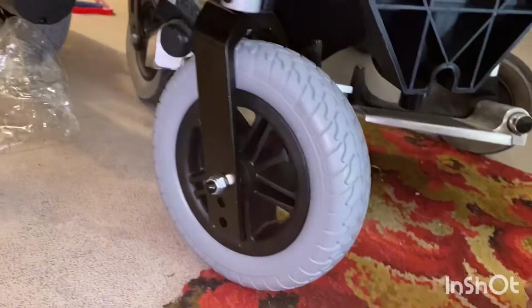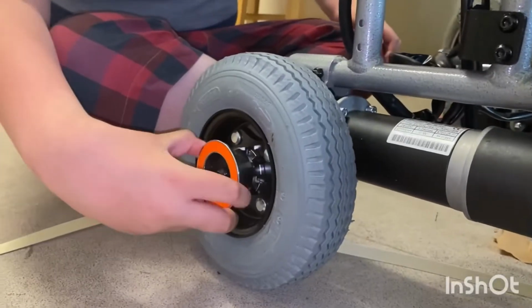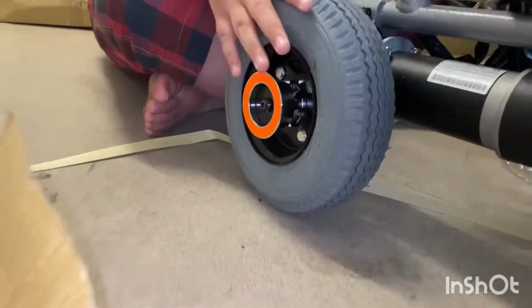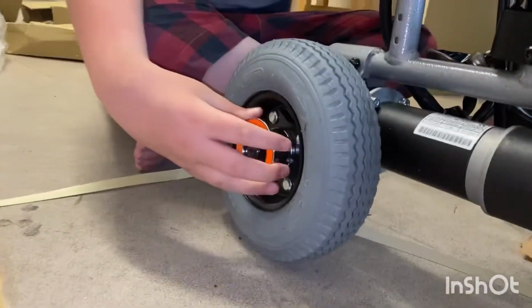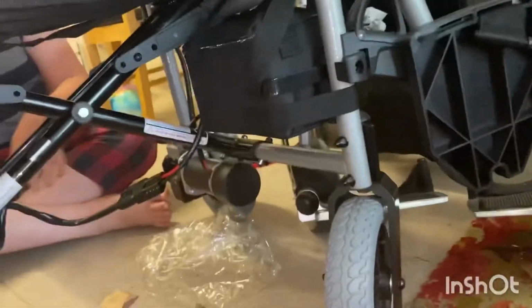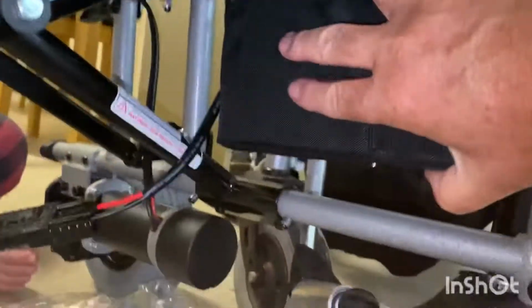It has another option. It's manual. If you switch this type of lever on the two back wheels, it can go from manual to automatic or electric. Here's me doing it. There, it just went to manual, and then when it's in, that means it's automatic. If the battery is gone, we can change to manual. It's super easy to push around, even if the battery runs out, it's fine.